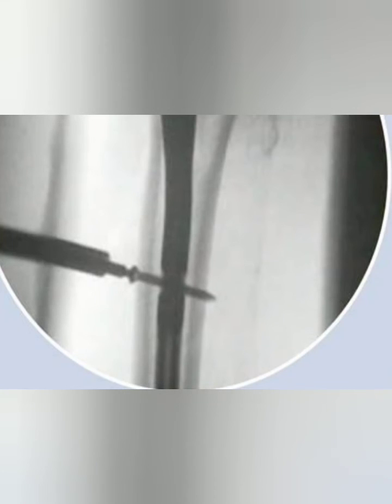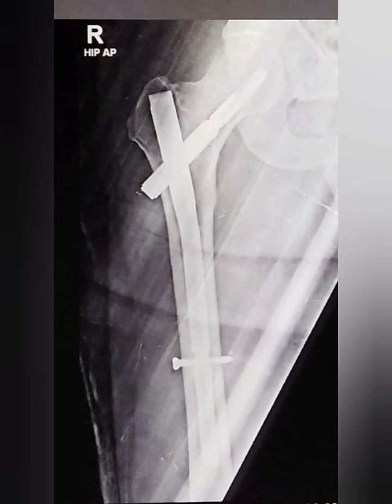Distal locking is done with the help of the jig, and then the jig is removed. This is the post-op X-ray showing perfect reduction and perfect nailing of the intertrochanteric fracture.